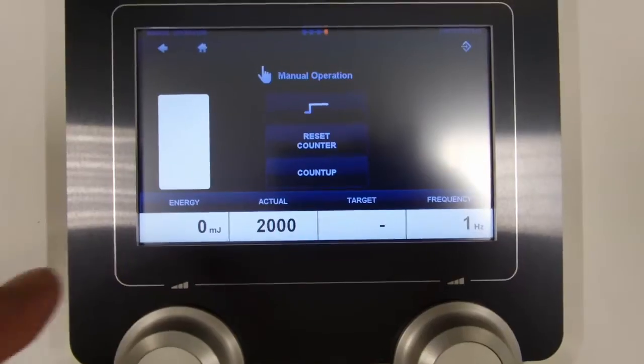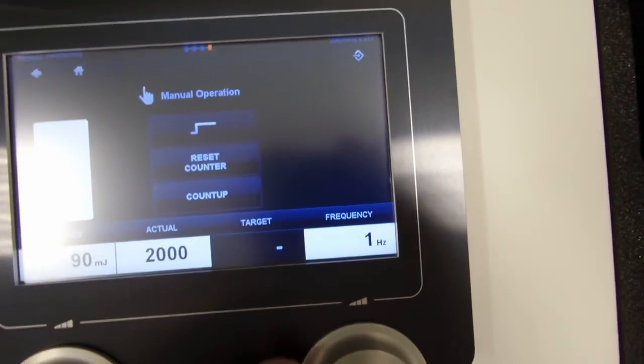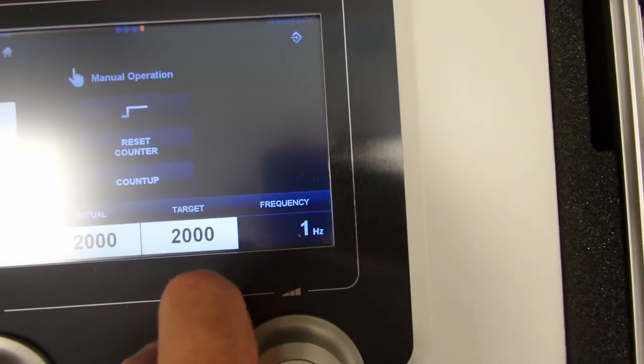You need to make the settings — we're going to go for 90 millijoules, 2000 shocks, a fairly standard number, and we're going to go at 12 hertz in this case.